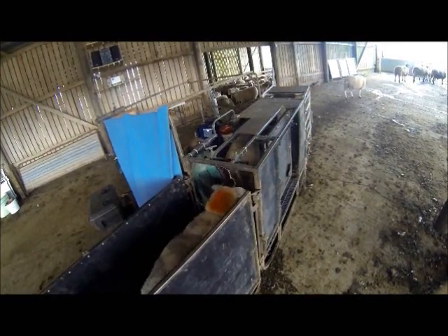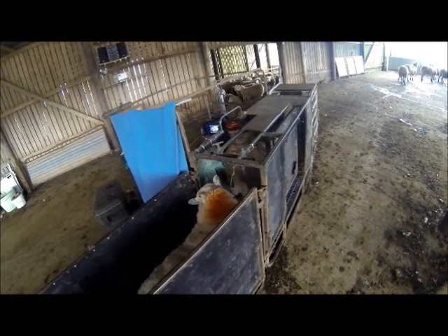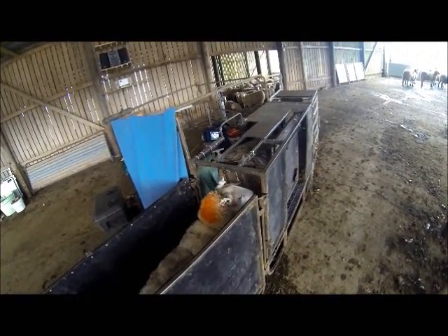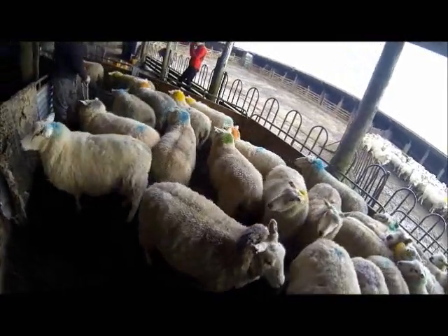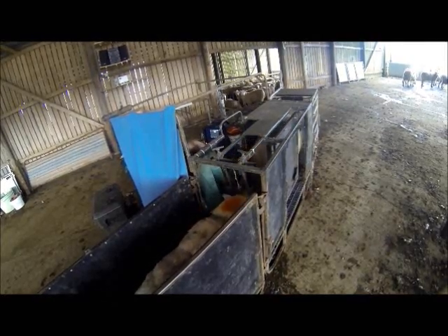Sheep being sheep, they follow each other up the race to be scanned. The scan man is very experienced and very quick at his job, so myself and the rest of the team have to keep the sheep coming. We all take turns at the jobs — one person filling the larger pens at the back of the shed, one filling the smaller end of the race, and one keeping them moving into the scanning crate.